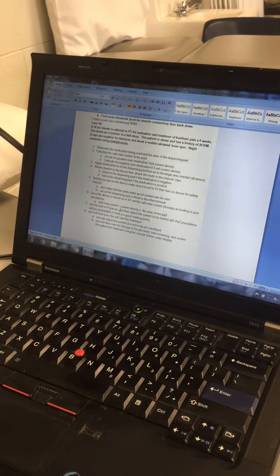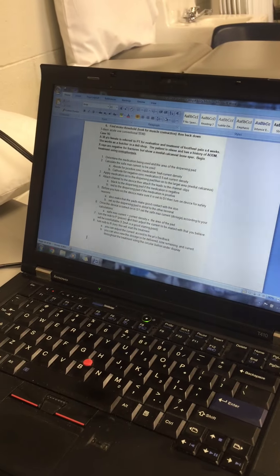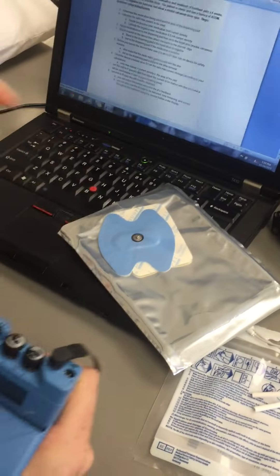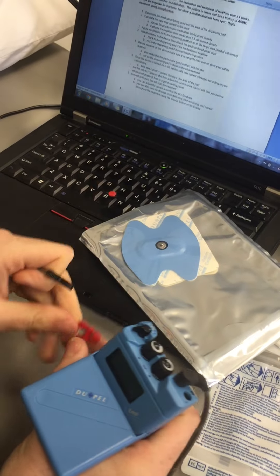Because it's bone spurs, we're going to be using acetic acid, which is negative, and we're going to place that on the negative cathode. We're going to use the black lead and put that right on there. We'll have acetic acid on this side, and then connect the black to the black.